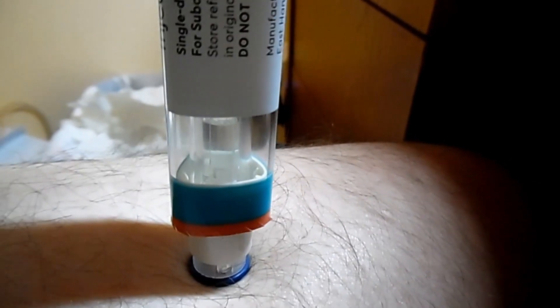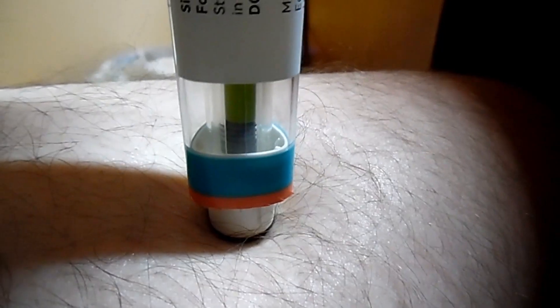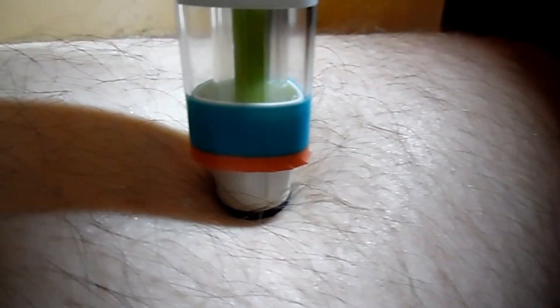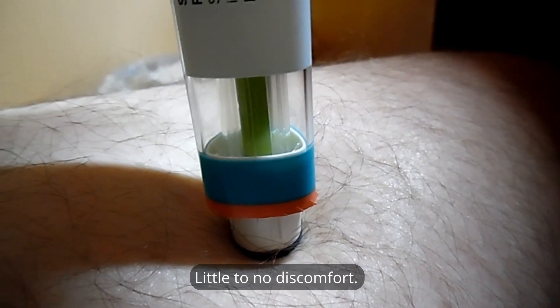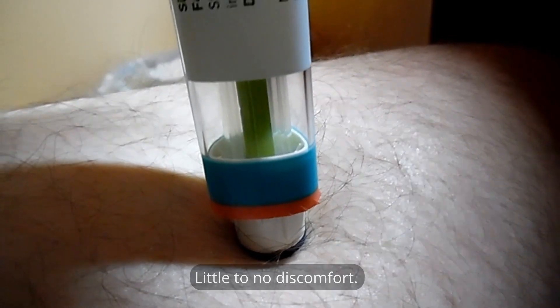Place it perpendicular to where you're going to inject and press down with some pressure. You should hear one click, then keep going and you should hear a second click. That is when it will be injecting you with the medication. When you see the tube of green on the inside, that means it is done.